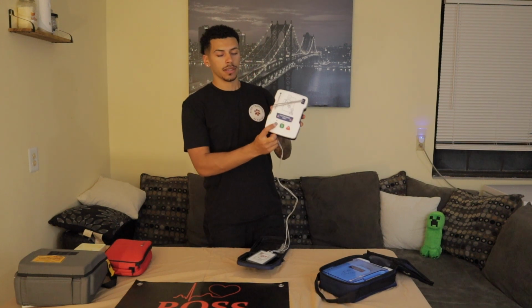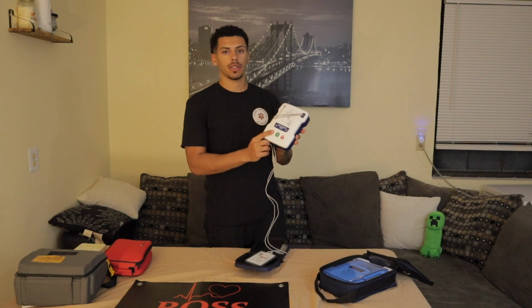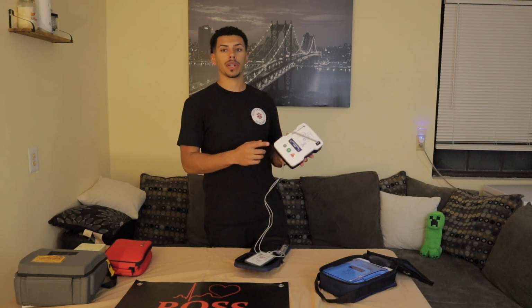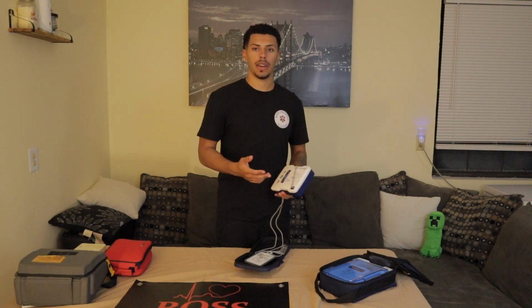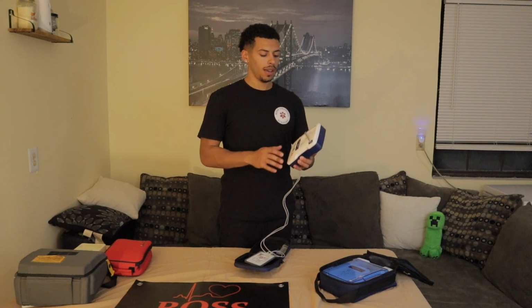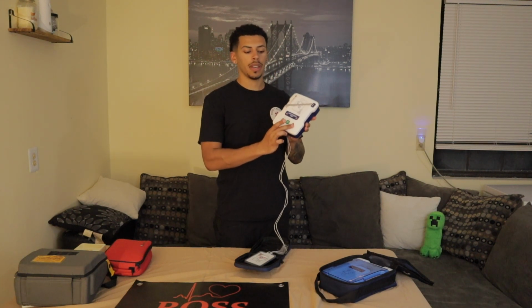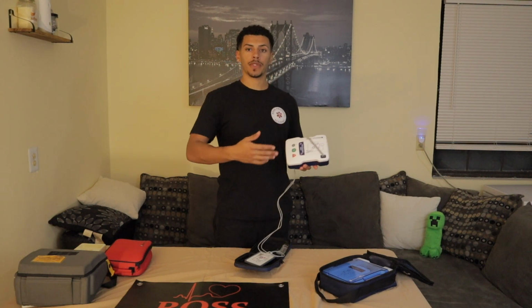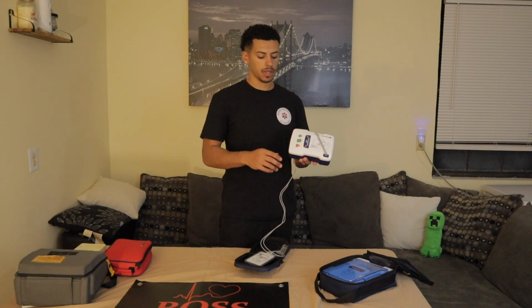Now, you might see this little gray button over here, and that's just going to be a pediatric button. So, if you're working with a kid, you'll just go ahead and hit that button. If you're not working with a kid, you will not hit that button. And by working with a kid, I mean the patient being a kid. But the other two buttons are exactly the same, just the turn on button and the shock button. Just like a lot of other real AEDs, they might have 3 buttons or they might have 2 sometimes.